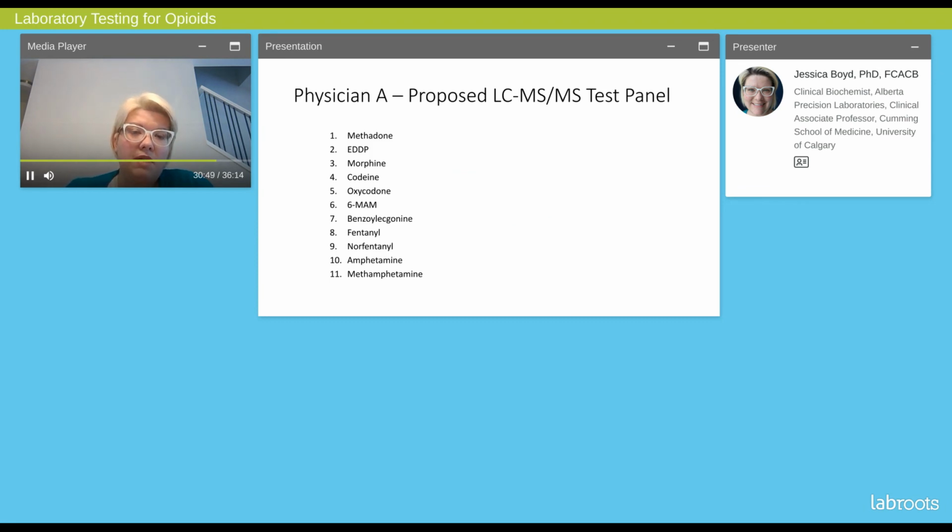So what I proposed to him was this panel, which was an LC-MS targeted panel that had, of course, methadone, EDDP.